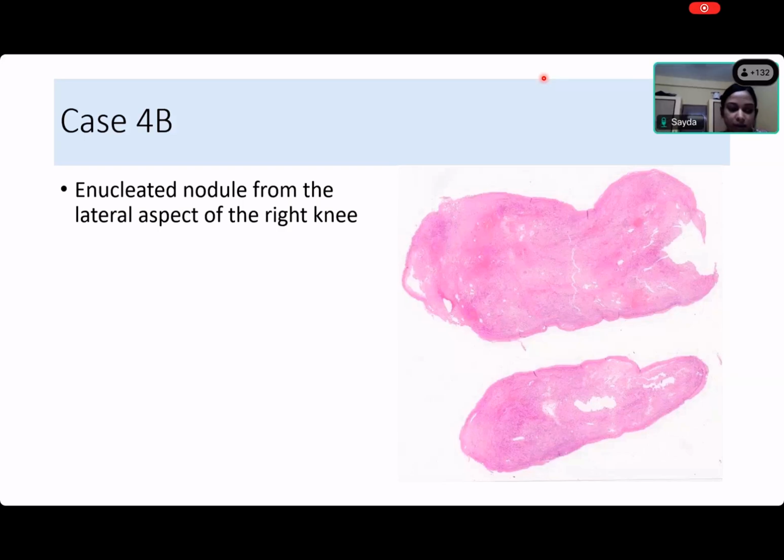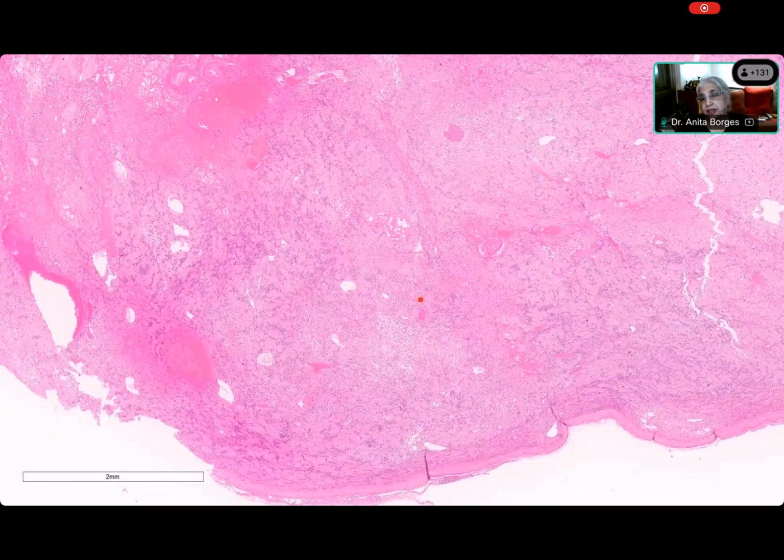It's an enucleated nodule from the lateral aspect of the right knee. Right knee. Yes. So what do you see? Ma'am, in the scanner view, we can see hypercellular and hypocellular areas. Is that what you're really noticing in the scanner view? It's an encapsulated lesion. No, that's what one can see. Beautifully encapsulated. Without a doubt, it's completely encapsulated. Right. So this is an encapsulated lesion. Now you can see that even in hyper. Yes, come on, it's got a capsule.